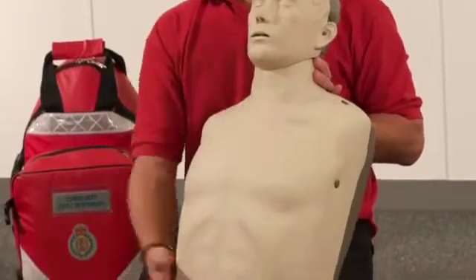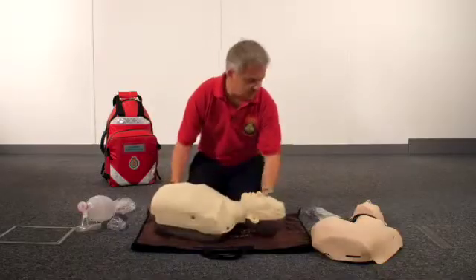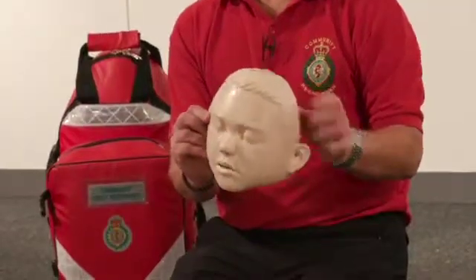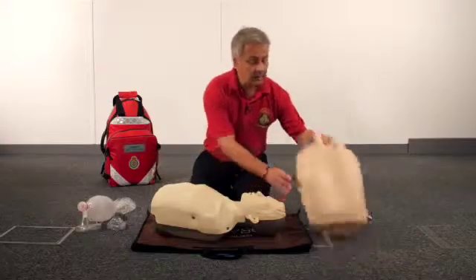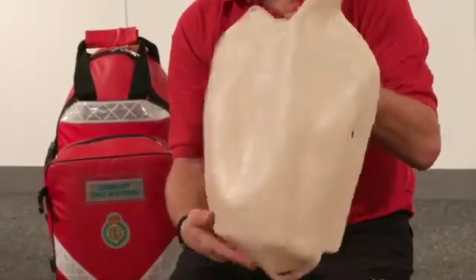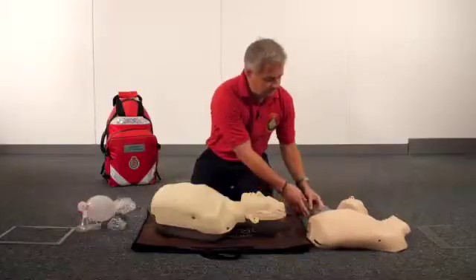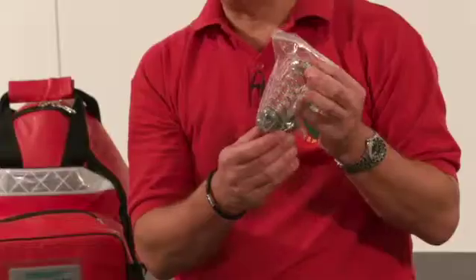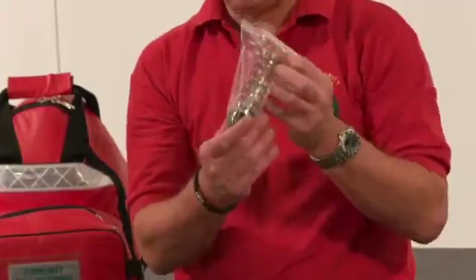The Brayden is obviously designed to be an adult mannequin, but the Conversion Kit has a face skin which represents a 10 to 12 year old boy, a torso chest piece which you can easily put onto the Brayden, and a replacement spring which is more representative of the compliance of the chest of a 10 to 12 year old boy.